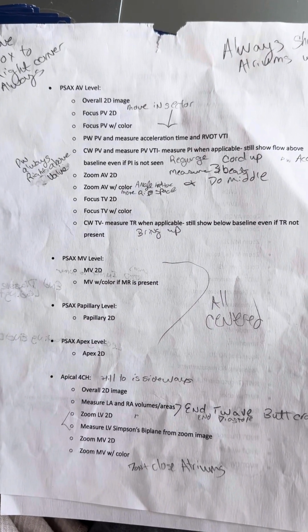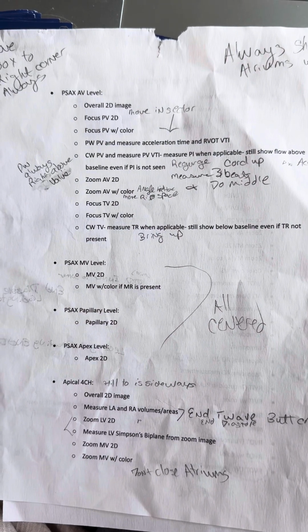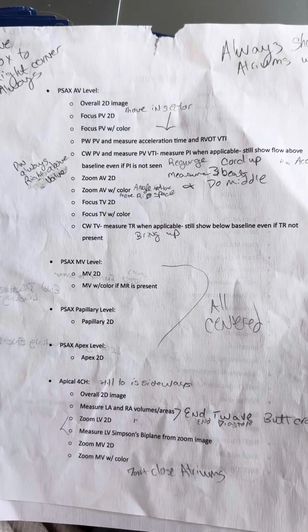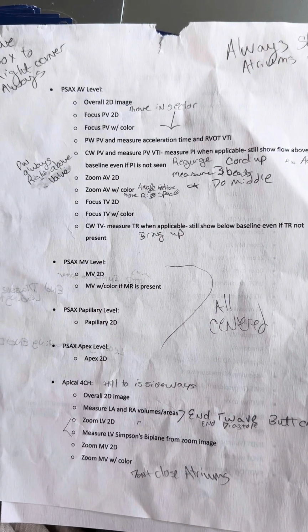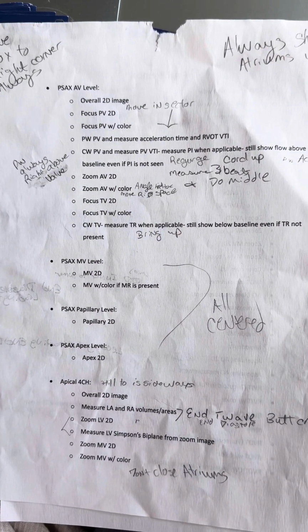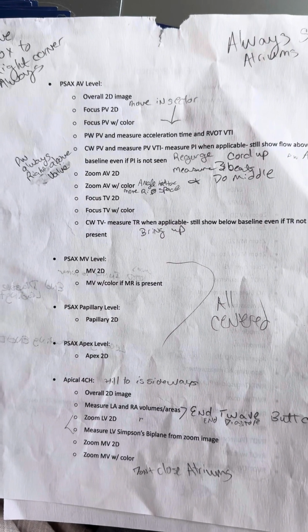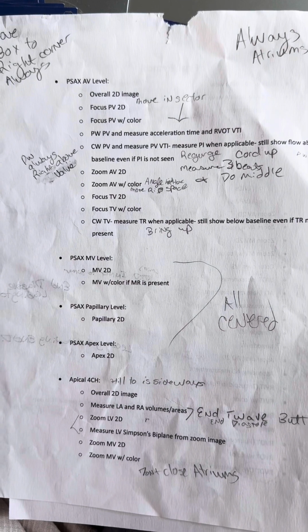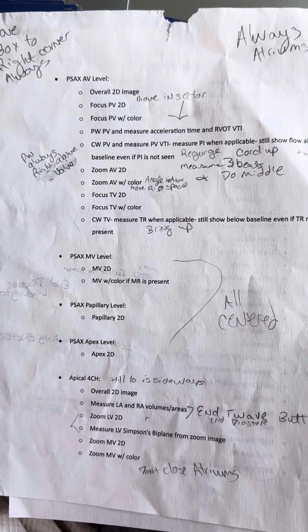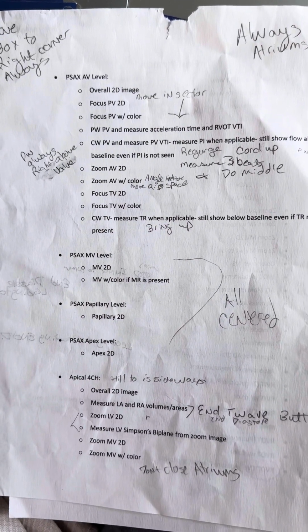Next, do your mitral valve at MV level. Put color on it. Then do your P-sacs PAP level. Then the P-sacs apex level.